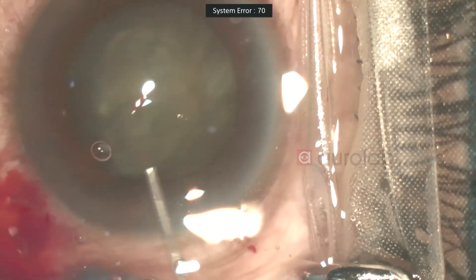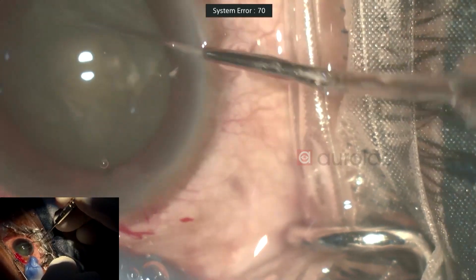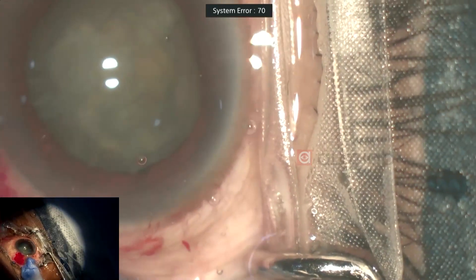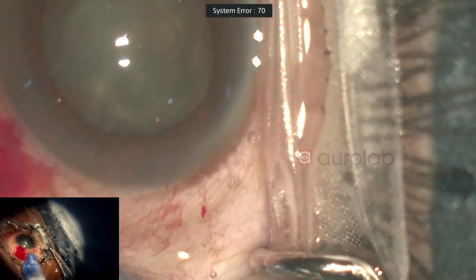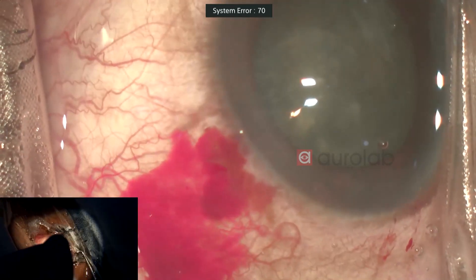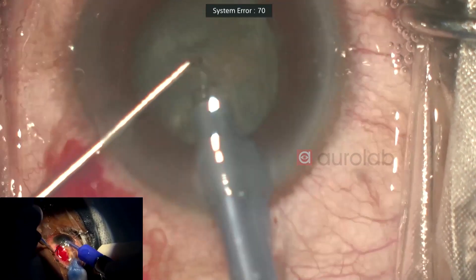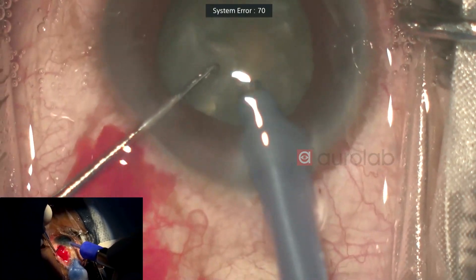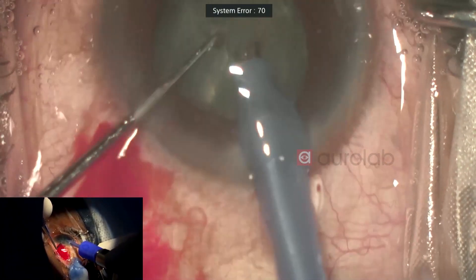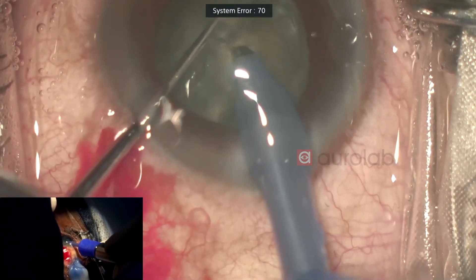Not a very good hydro, so I'll just repeat my hydro. Now we can see the nucleus rotating freely, which will be helpful during the phaco. I'm using grade 2 settings right now. If need arises, I'll switch to grade 3 depending upon how it's going.